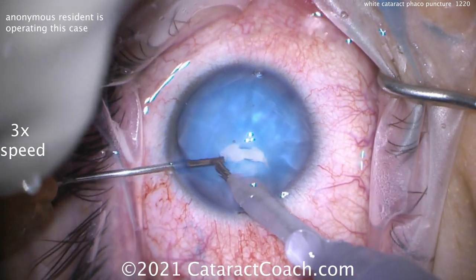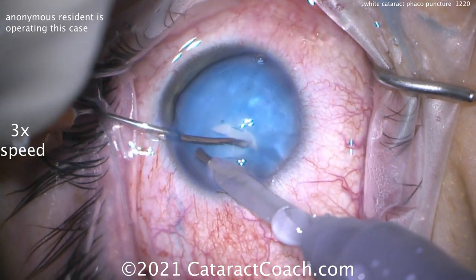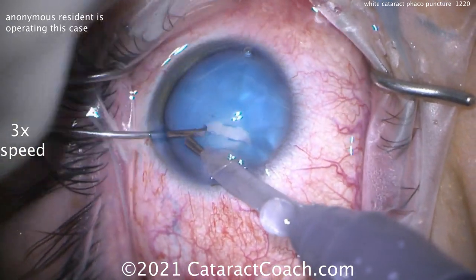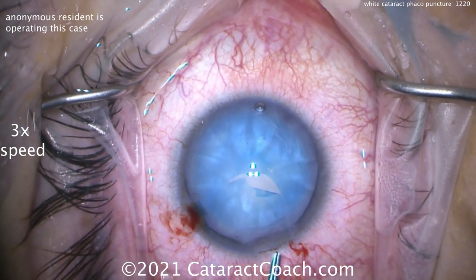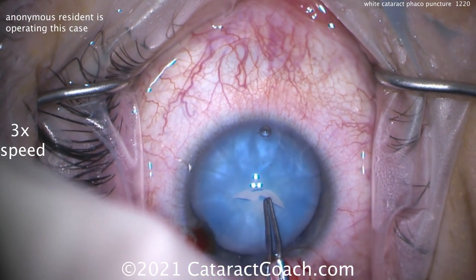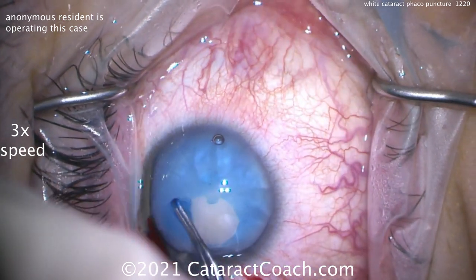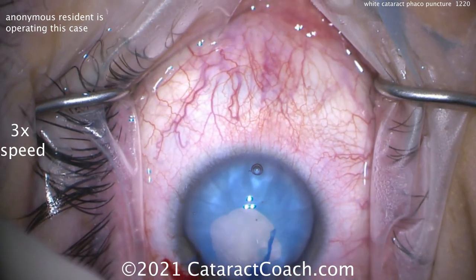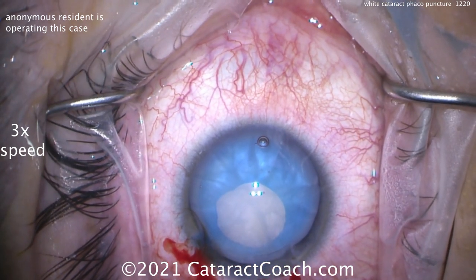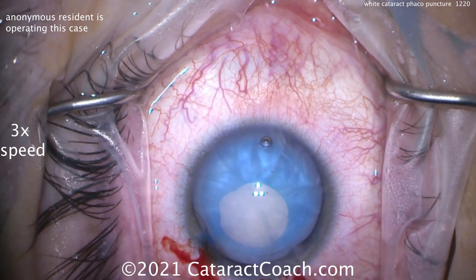Now we're going to try with the other hand to get a little rhexis done, keeping the infusion in the eye. That didn't quite work, so we can put the viscoelastic in. Luckily it's not running out — we were able to decompress the bag enough. So now we'll grab that and just make a baby rhexis here. It doesn't matter if it's centered or not, we'll fix all that. That's enough of an opening, and don't worry that it's not centered — we're going to center all this up in good time.